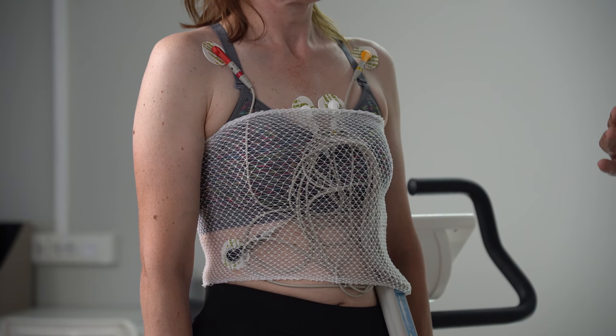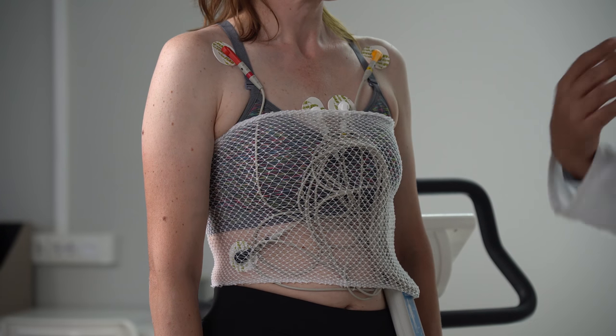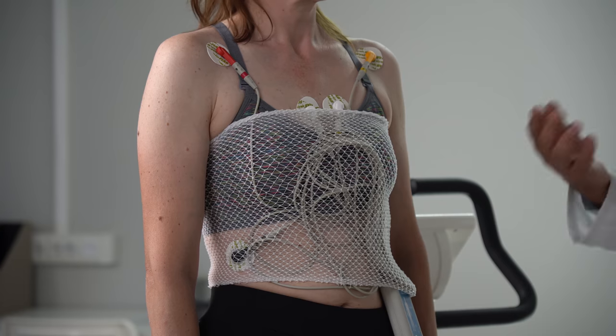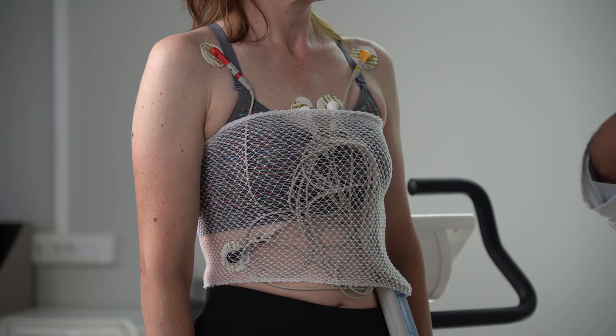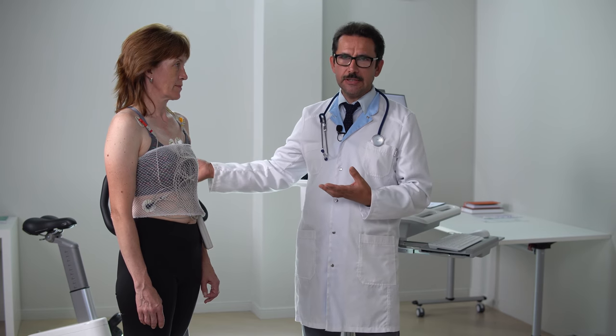All in all, this scheme provides an ECG that's comparable to standard, but you can never compare an ECG recorded in the standard and Mason-Likar positions because, for example, the heart axis will be a little bit different, the voltage of these leads will be a little bit different. But for the exercise stress test, we compare the ECG recorded during the rest period of this exercise stress test and during the exercise period. So we do not compare the standard ECG and the ECG by the Mason-Likar system.